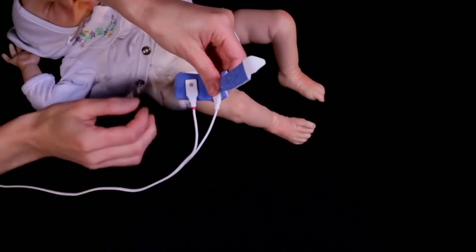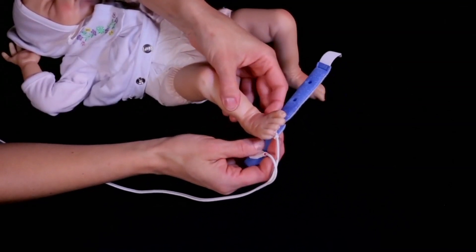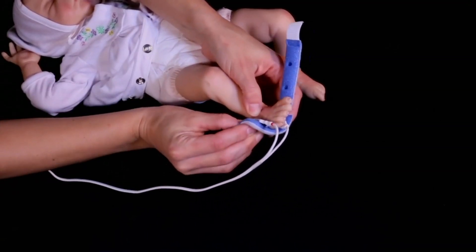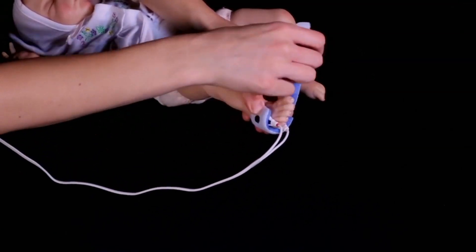Orient the Y1 sensor on the selected site so that the detector window is on the fleshy portion and the emitter window, marked with a red indicator, is directly opposite. Orient the cable along the side of the foot.